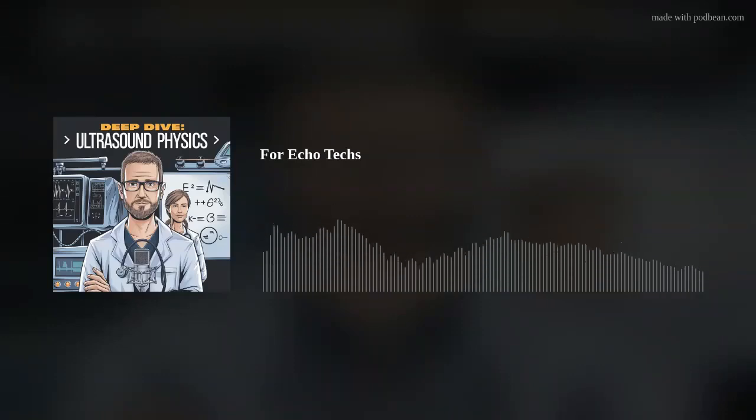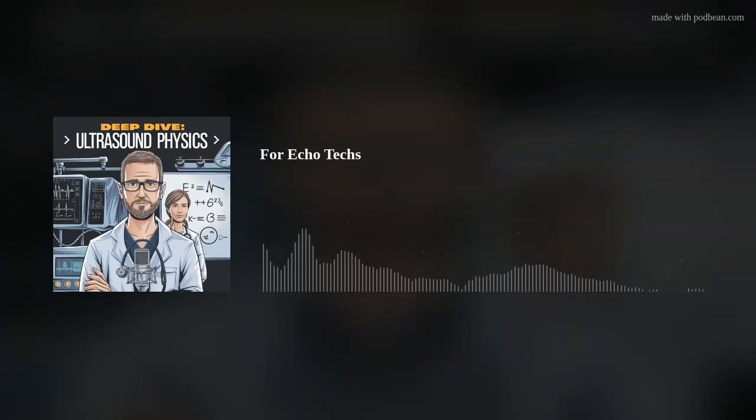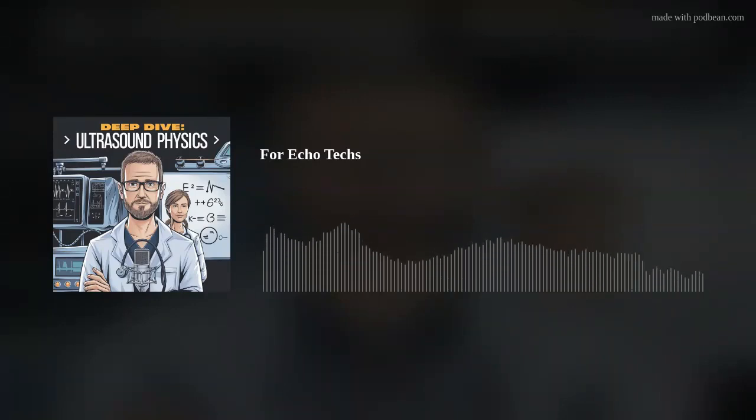Okay, so before we got sidetracked by all those other incredible echocardiography techniques, we were talking about how we can actually stress the heart to learn more about its function. Oh yeah, stress echocardiography. Right? Can you refresh my memory on that? Absolutely. Stress echocardiography is a technique where we observe how the heart responds to exertion, either through exercise or medication. So it's like we're giving the heart a challenging workout to see how it performs under pressure.